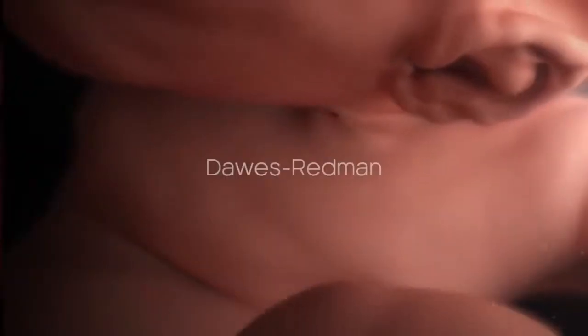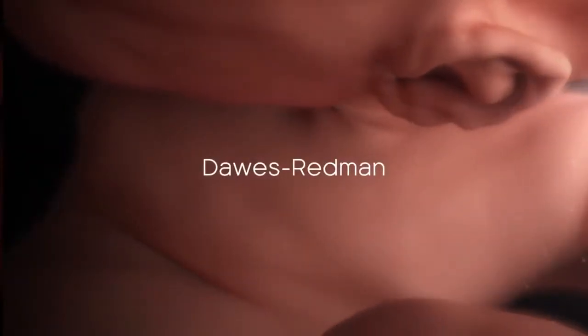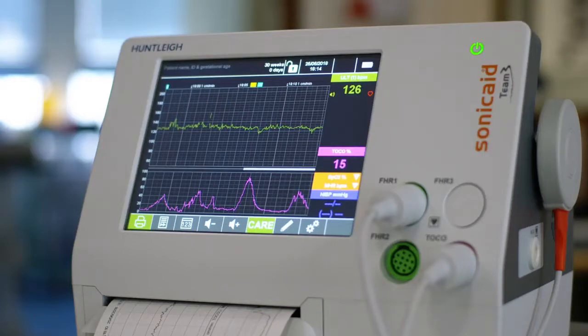And I took that idea to a fetal physiologist called Geoffrey Dawes, who was director of the Nuffield Institute of Medicine. That's why it's called the DawesRedman program. There are accelerations and variability and decelerations that you can see, but the DawesRedman looks at the short-term variation that you can't see with the eye.